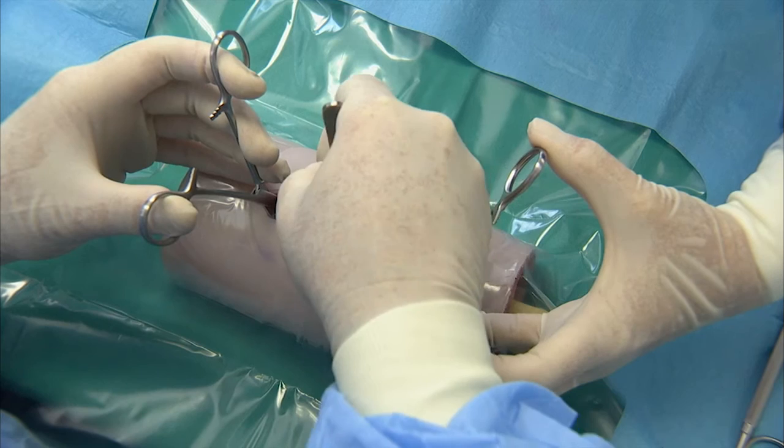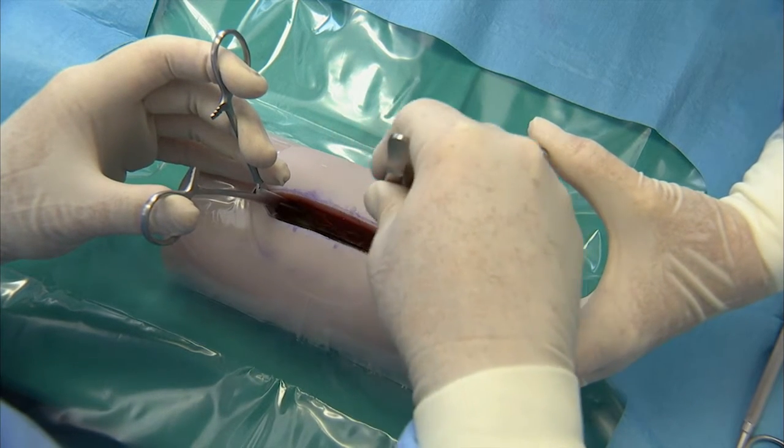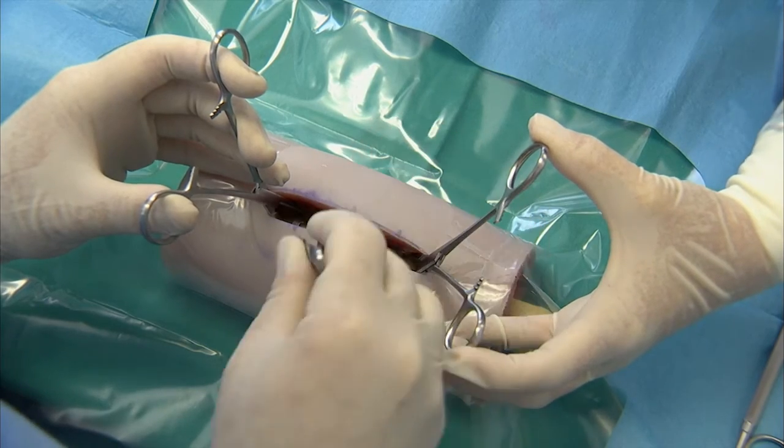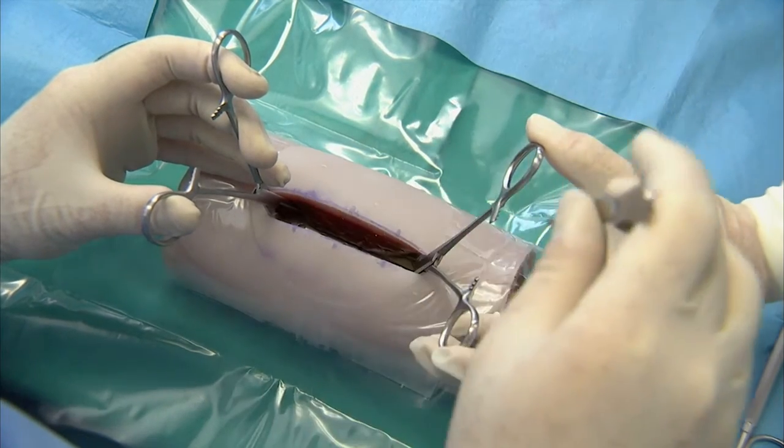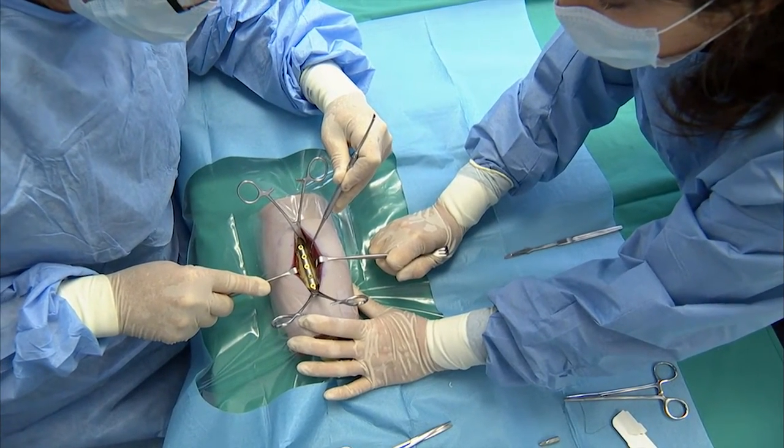To redo the plating procedure, move the plate over onto healthy bone and repeat the process while taking care to maintain a good reduction of the fracture and proper alignment of the bone. Blame the assistant if the reduction is inadequate for a second time.